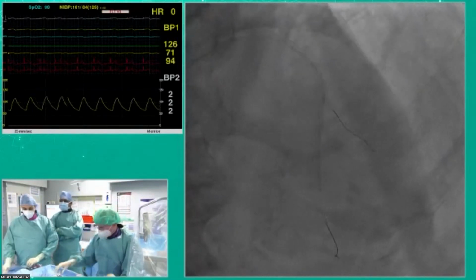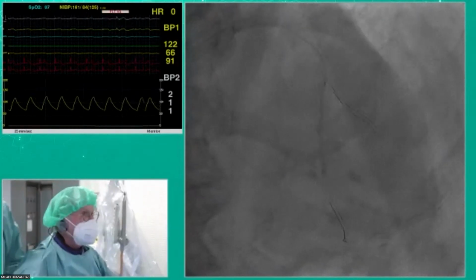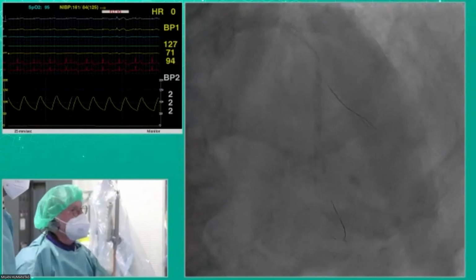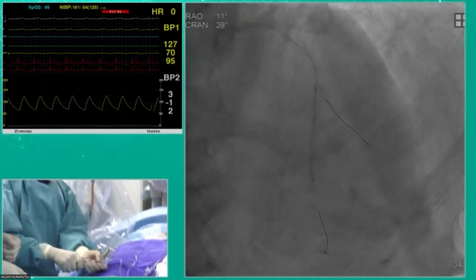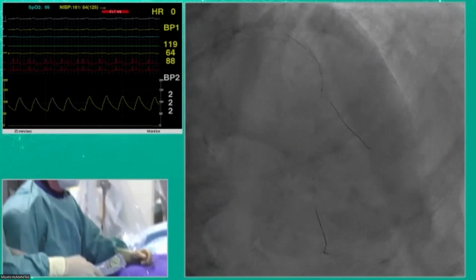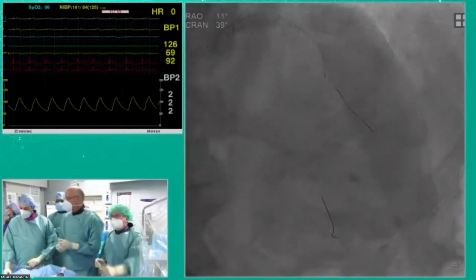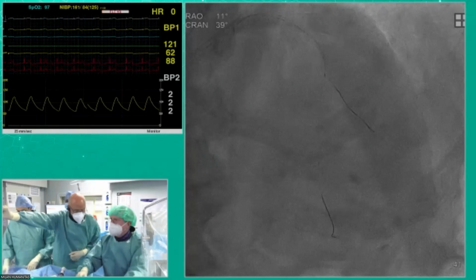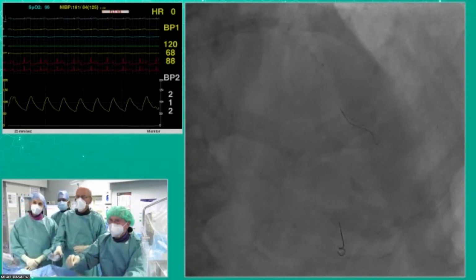So Antonio, what are you doing these days with these? You leave it alone if the flow is fine. Would you do physiology too, right? Would you always do physiology? I used to do physiology. I use physiology much less now, because I kind of learn by angiography, which is the one. And I don't keep on injecting, of course. But you see, the dye clears pretty well. And we do a 3.20 Magic Touch proximal. Okay, 3.20. Is 20 long enough?